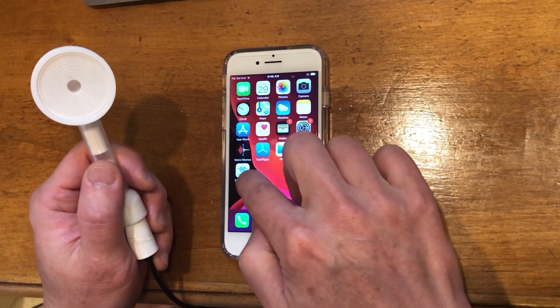The Bluetooth stethoscope and digital stethoscope has existed for a while, but they've all been very expensive. This is an inexpensive design — less than $20 — and it's very simple to use.